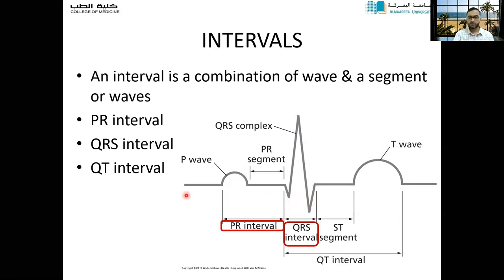Similarly, we have the longest interval here, the QT interval, which shows you the whole time for ventricular depolarization as well as repolarization, the recovery. The whole ventricular activity is shown by the QT interval here.